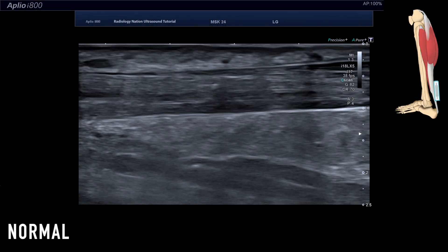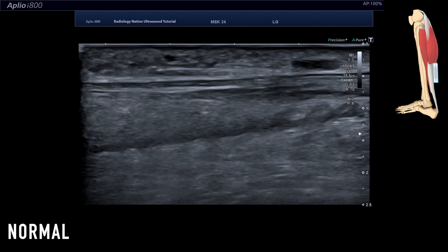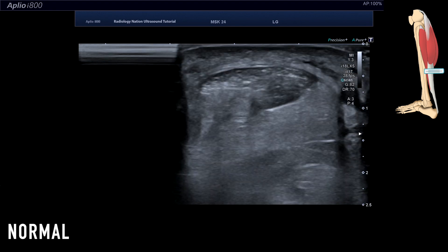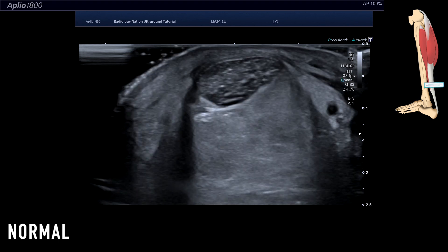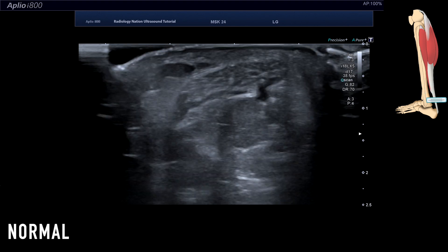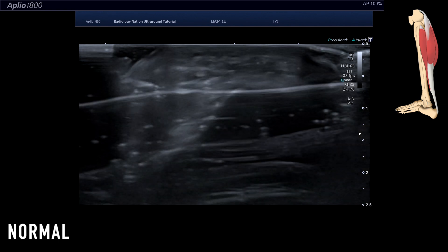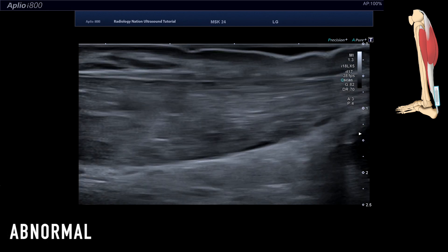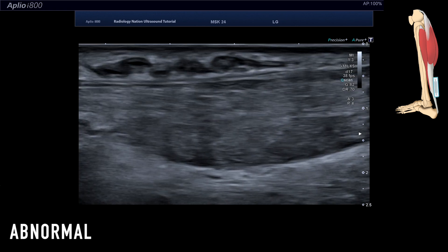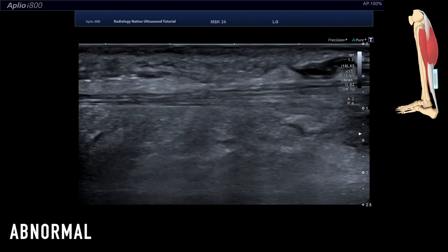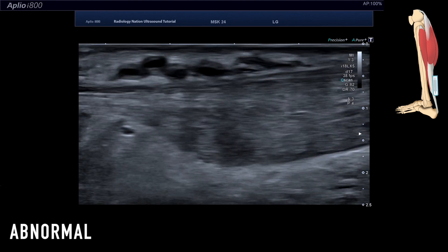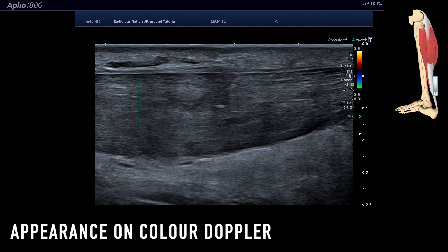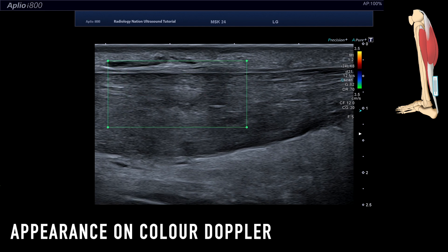Now let's look at an example of Achilles tendon pathology. We see a normal Achilles tendon in longitudinal and axial orientation, then compare to the opposite abnormal side. We can see that the Achilles tendon has a focal area of increased thickness above one centimetre and that the shape of the tendon is much more rounded. This is an example of tendinopathy, which usually occurs due to overuse and excessive long-term stress upon the tendon, resulting in enlargement, disruption of the fibres, and increased vascularity.